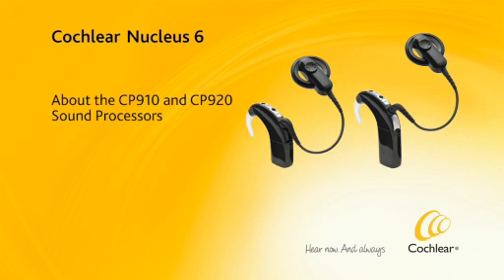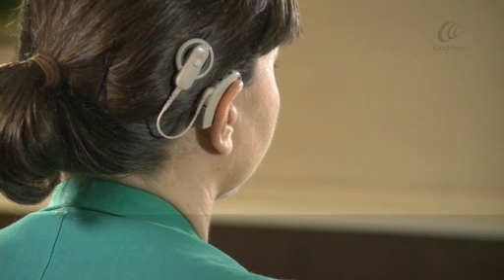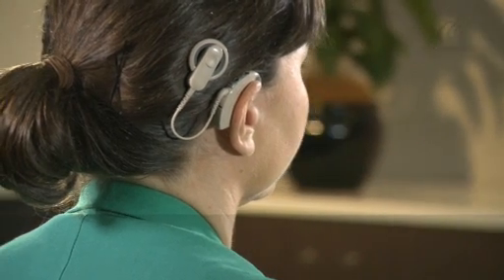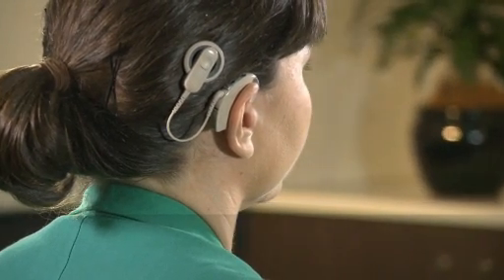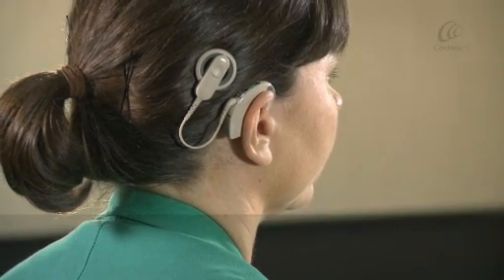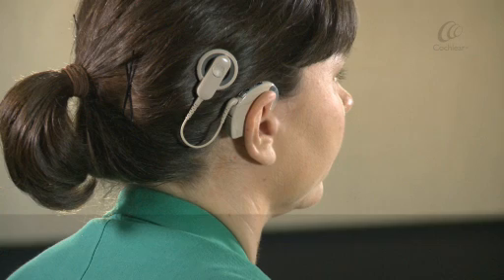About the CP910 and CP920 sound processors. Your Cochlear Nucleus 6 CP910 or CP920 sound processor works with your cochlear implant to transfer sound to the auditory nerve.